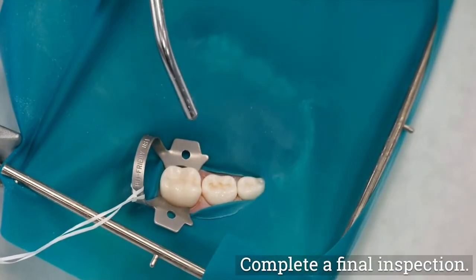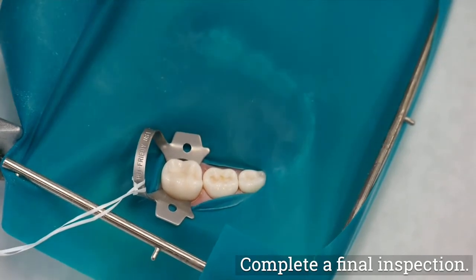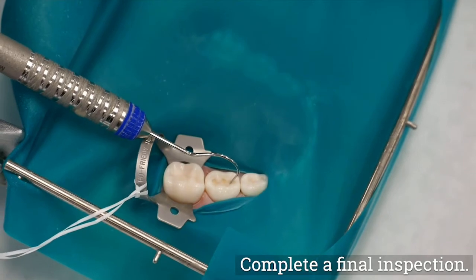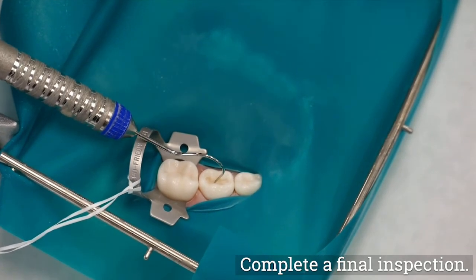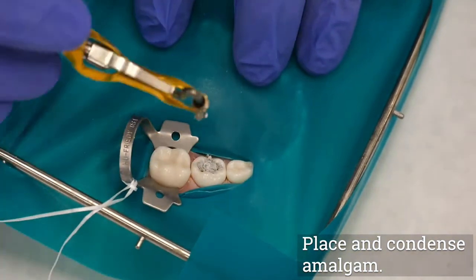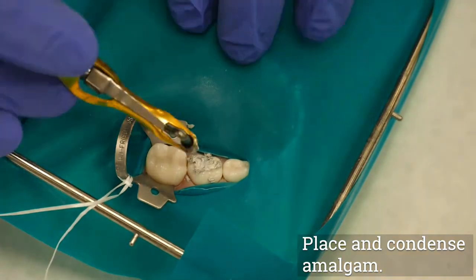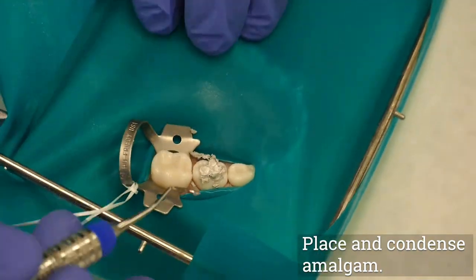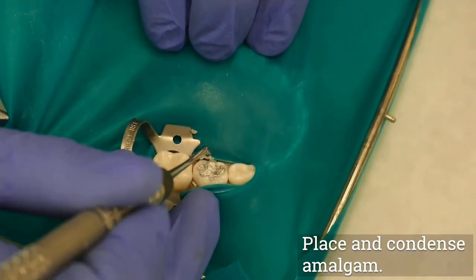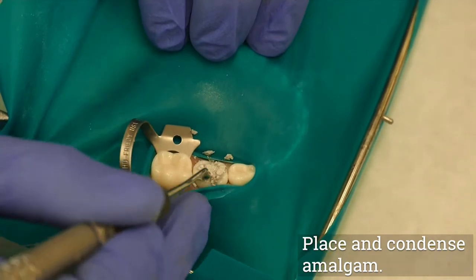Rinse and dry the preparation and complete a final inspection for any remaining caries, sharp cavosurface margins, and unsupported enamel. Triturate the amalgam and place one carrier load of amalgam into the preparation. Using a small condenser, immediately begin condensation of the amalgam into the preparation. Use small overlapping increments with firm pressure until the cavity is slightly overfilled.